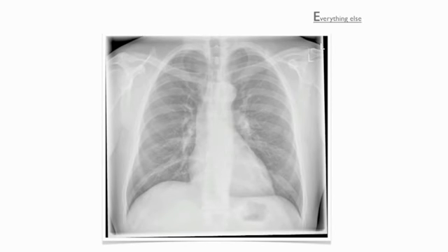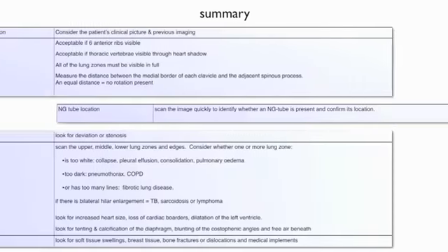This concludes our review of the Piper N ABCDE mnemonic. We've covered an awful lot of material, so here is a summary for you to pause and print.